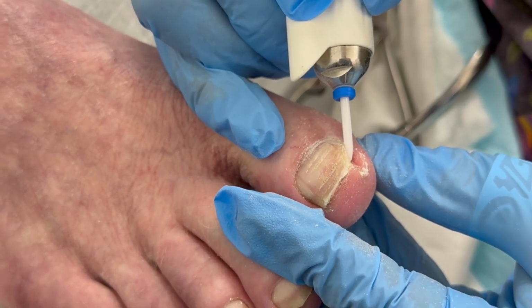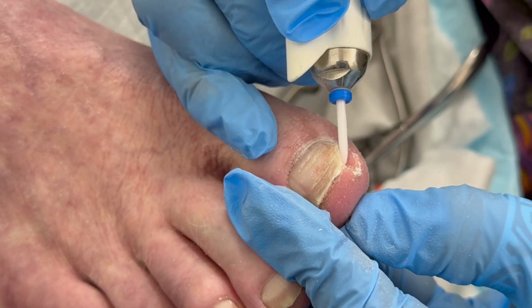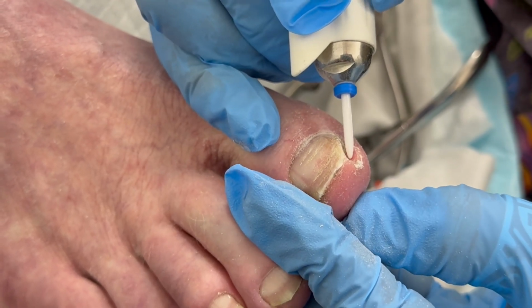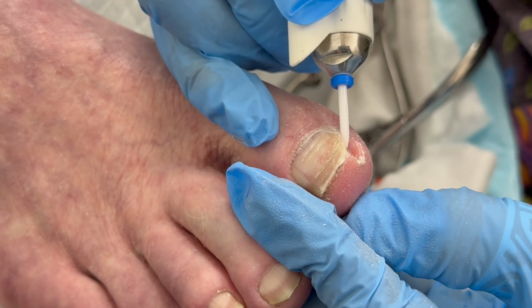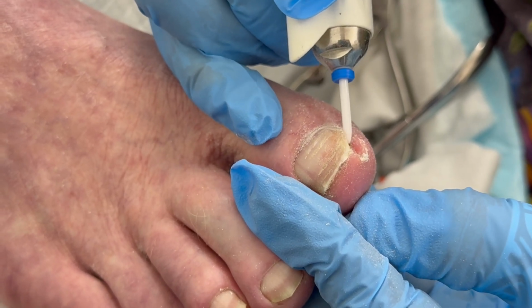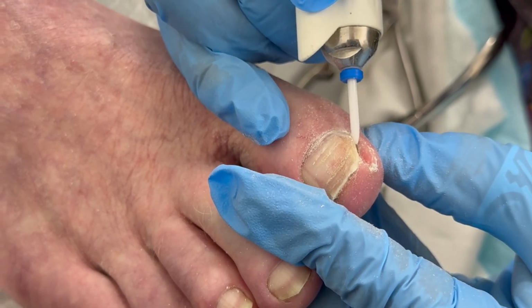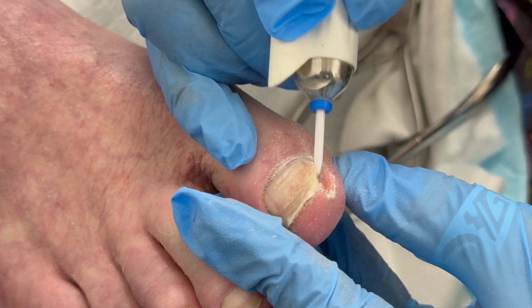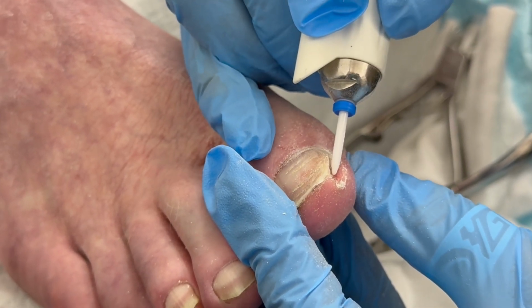So this is not obviously something that a lay person can't learn to do, but do not try this at home. My goodness. But just to show you that you can take care of these massively ingrowing nails. It just takes time and patience and lots of different pointy bits.